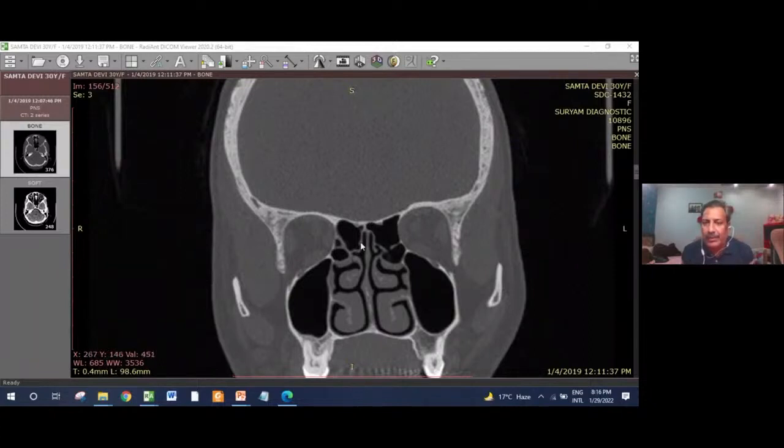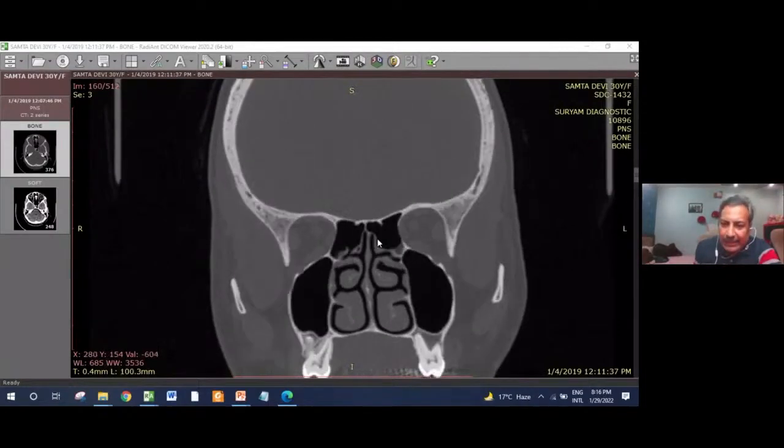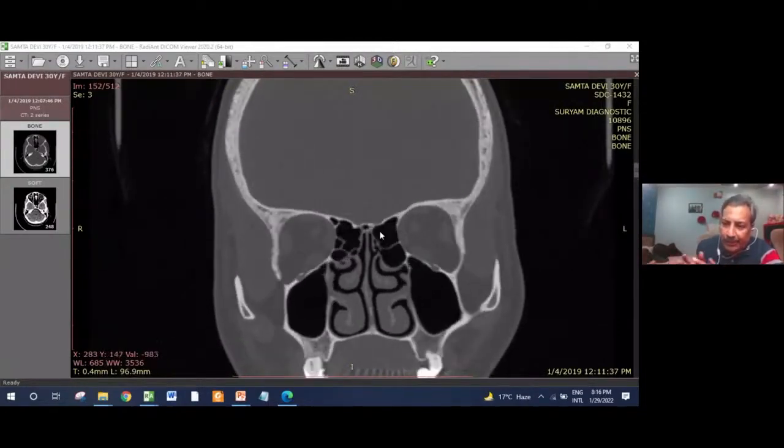Relatively a thick roof, and you can deal with the turbinate in a much better way than dealing with a dicey middle turbinate attachment. And every surgical move, see, this is so important to deal with every structure. You can refer to standard teaching from Dr. Dharamveer Sethi, who has practically revolutionized this surgery in our country through his hundreds of workshops, almost 2 decades before now.